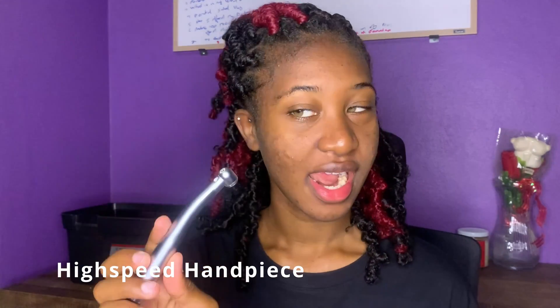Then this is my high-speed handpiece. A burr goes into this part and we use it for preparation — we'll use it for cutting the tooth, basically.